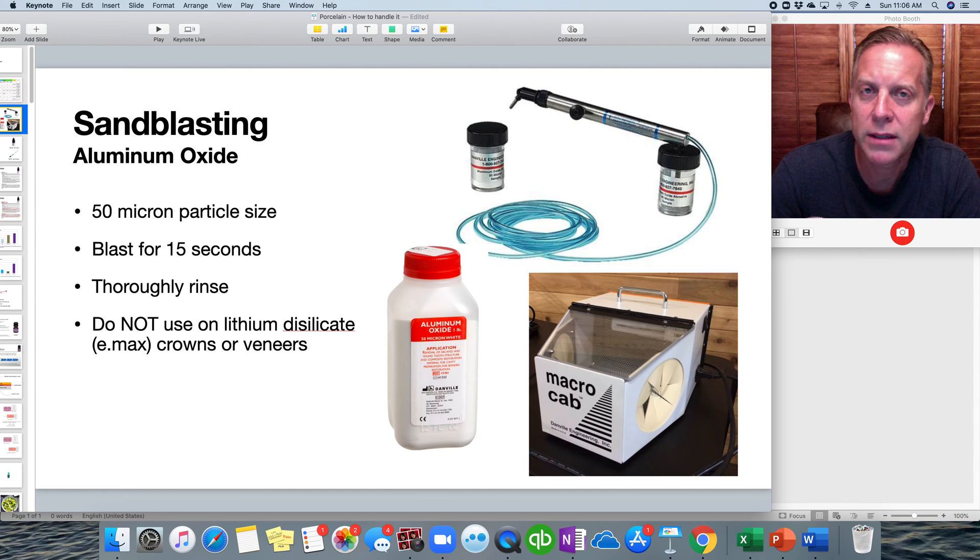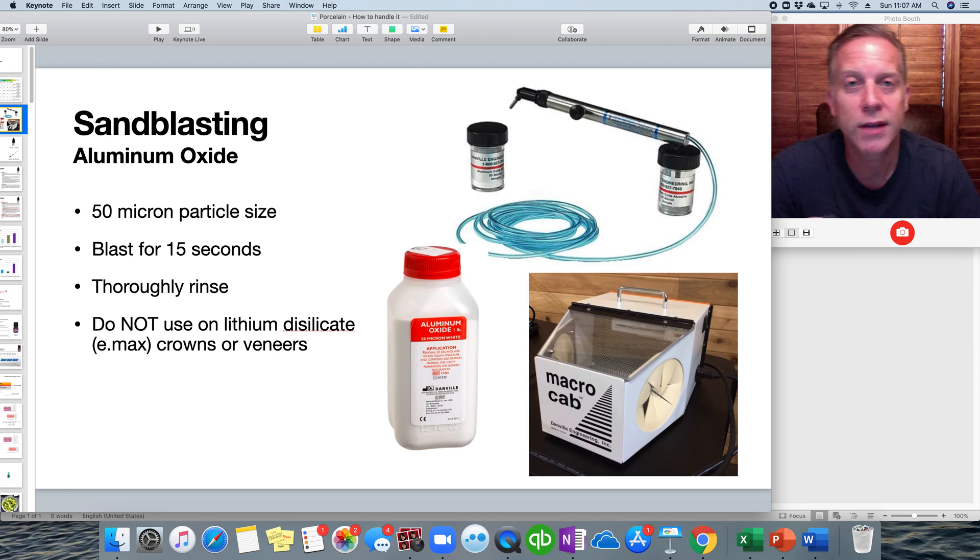There are mixed opinions about sandblasting lithium disilicate restorations, meaning Emax — veneers and crowns. In our office, we're just not going to sandblast Emax because some instructions say specifically not to. Ivoclar Vivadent actually states not to sandblast the internal of an Emax restoration; they want you to use hydrofluoric acid instead. We will, however, sandblast metal and zirconia.